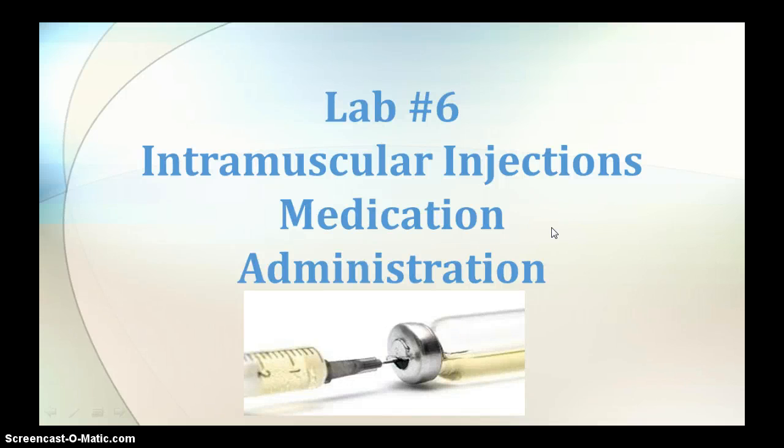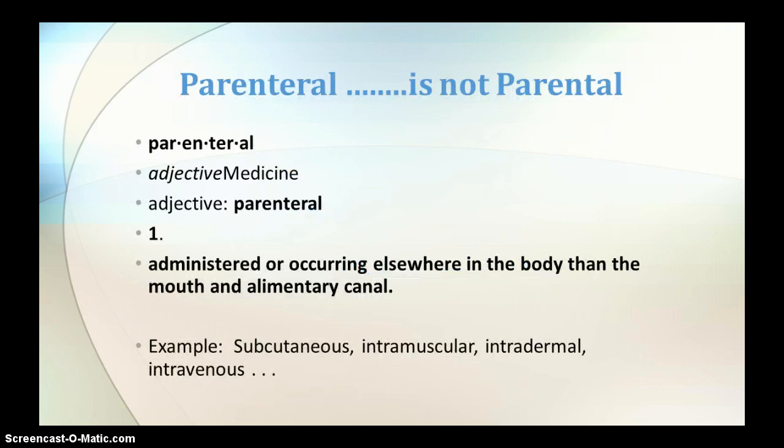Hi, this is the lab prep for lab number 6, intramuscular injections med administration. First off, I'd like to go over a word that you may not be that familiar with, and the word is parenteral. And it is not parental as it says on the slide.